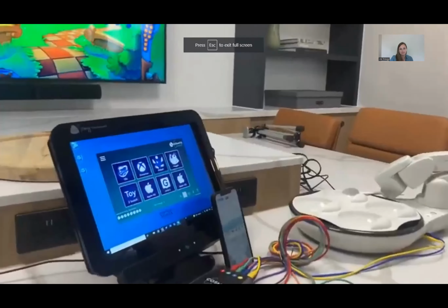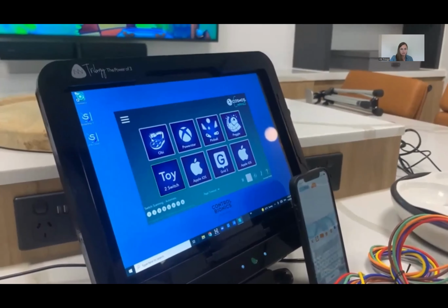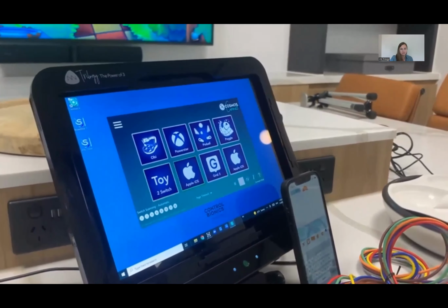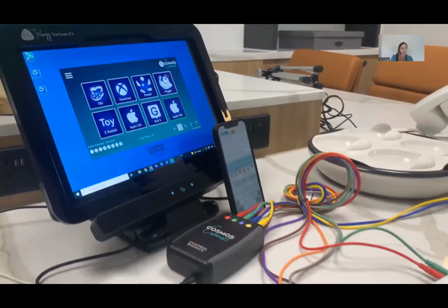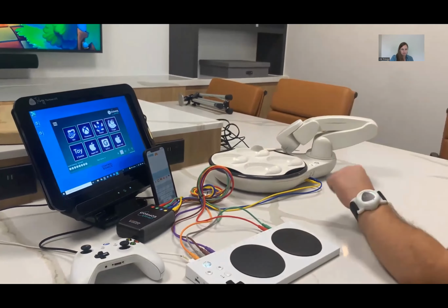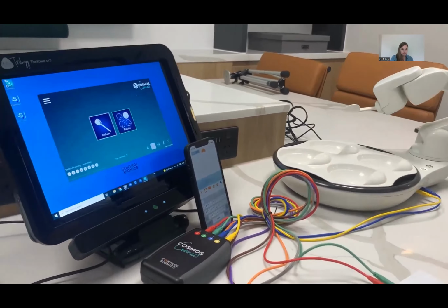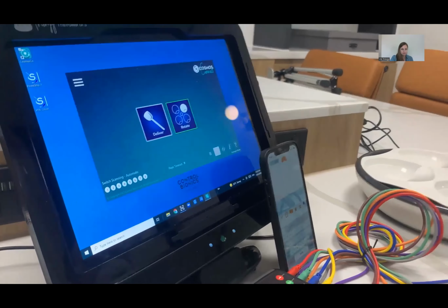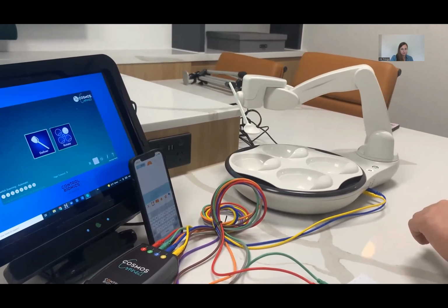Pinball. Peggle. Scan through. 2 switch toy. iPhone. Grid 3. MacBook. Obi. Deliver. Just wake it up. Rotate. Deliver. That's still waking up, isn't it? You're ready to go.